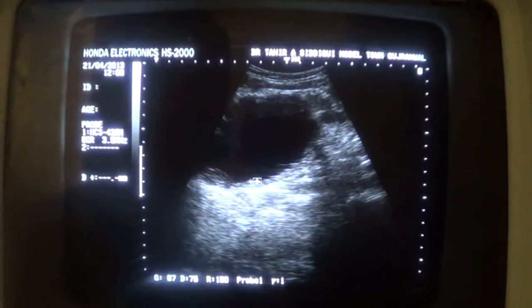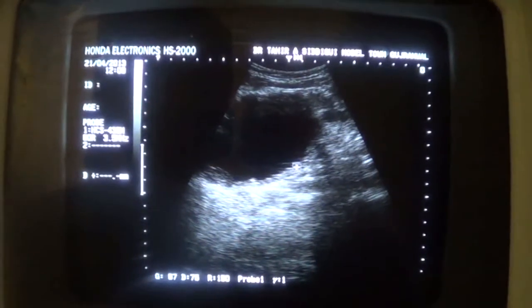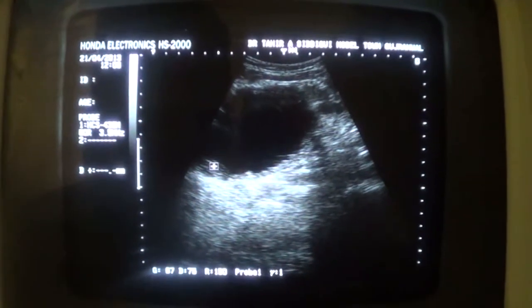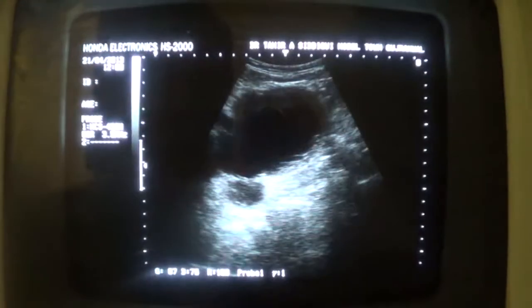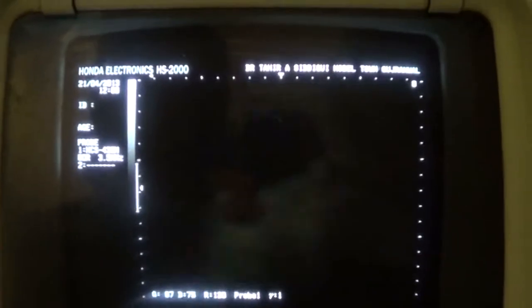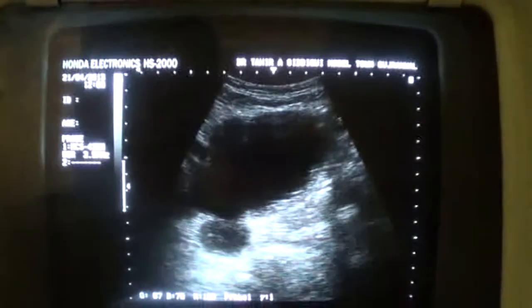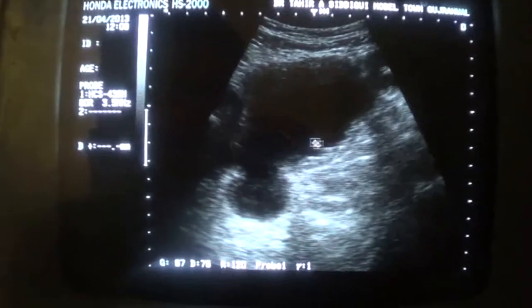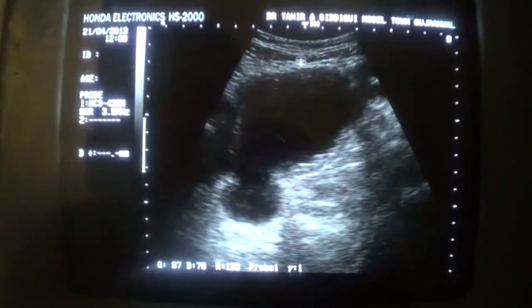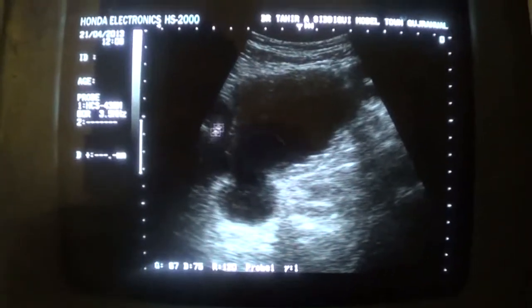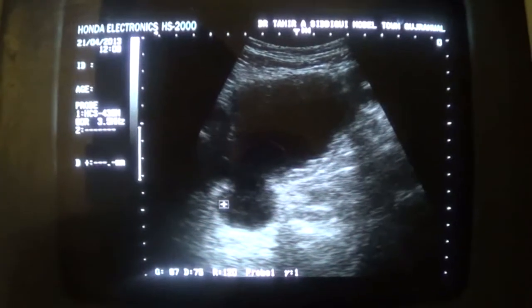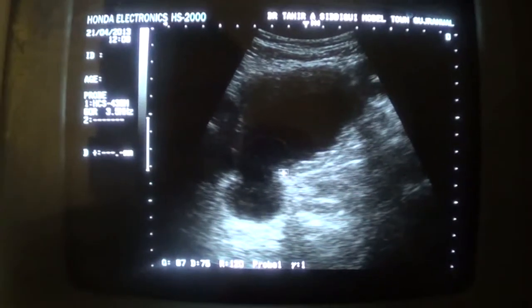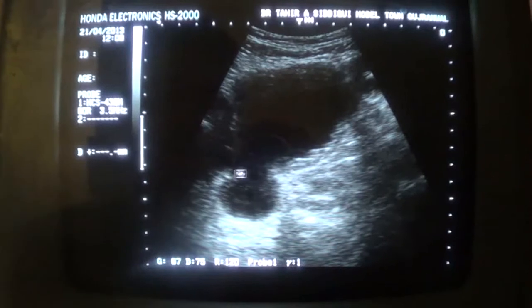This is the posterior of the urinary bladder in transverse section, and here we can see a small outpouching from the posterior wall. This is the urinary bladder and this is the small outpouching — the diverticulum — at the posterior wall.